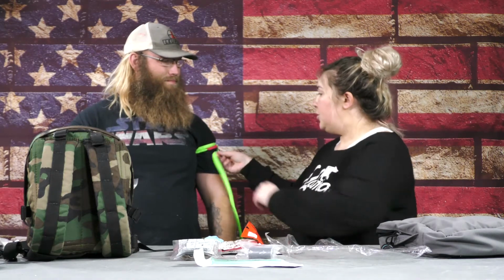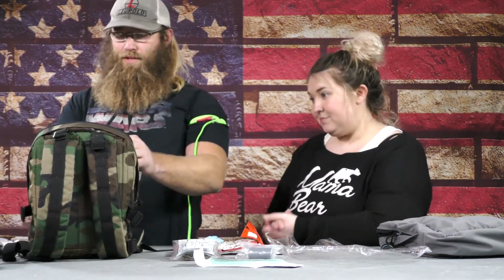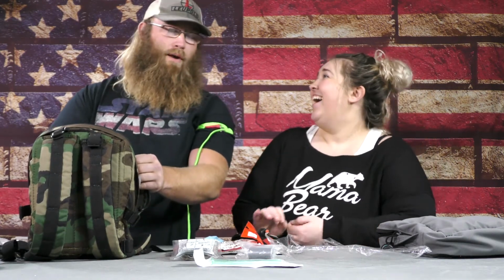These were built to go one on top of each other like this. The wider it is, the less painful. These are one of the more painful tourniquets to have put on, because it's so thin. But they are so effective, I don't care. Your pain is not going to kill you. Bleeding out will. I'm going to let you talk about these other ones while I go get Shelton to take this one off. And here's the thing too, guys, for practice, tourniquets hurt like crazy.